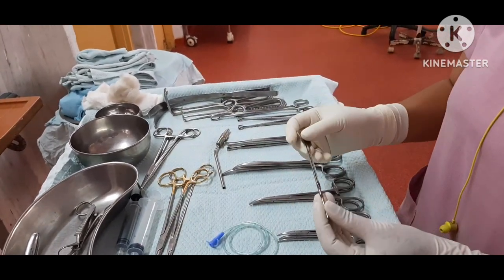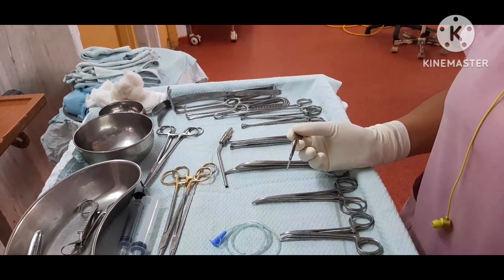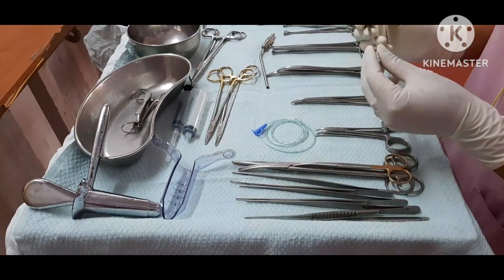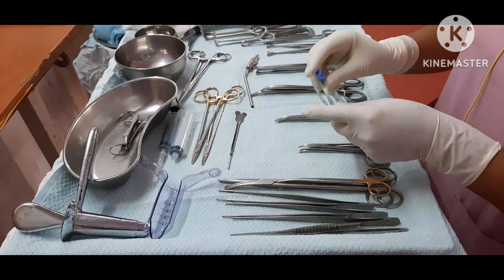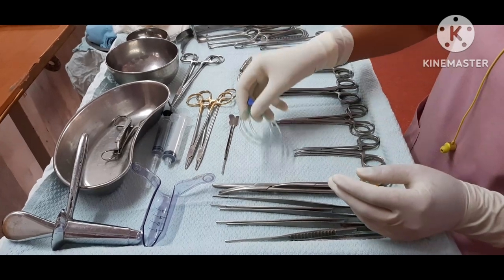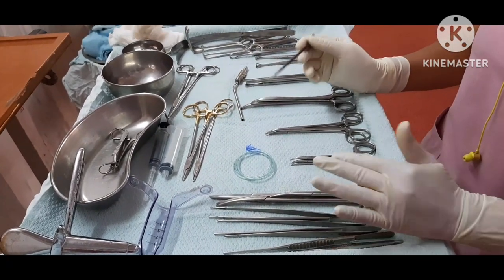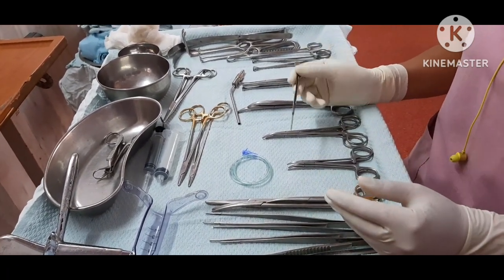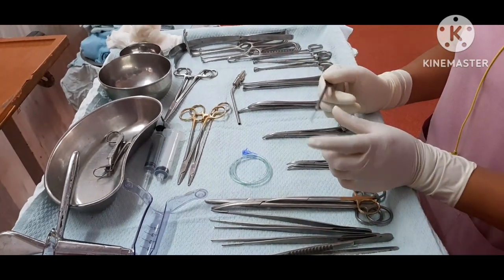The main instruments for fistula surgery are butterfly cannula, proctoscope, and disposable proctoscope — which is the slit proctoscope. This is the infant feeding tube. Fistula is an abnormal connection between two organs. Where there is a fistula, we use a butterfly cannula.